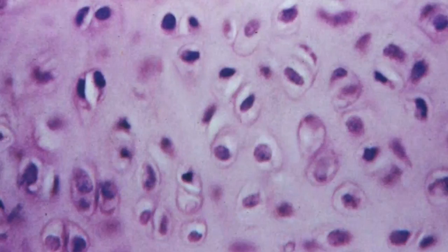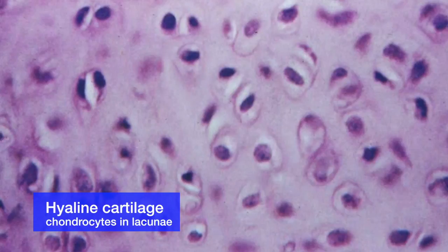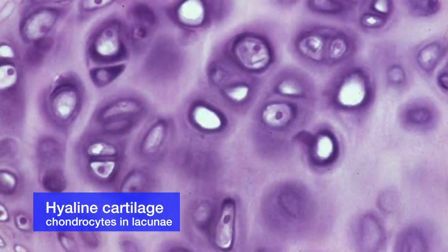The first type of cartilage is hyaline cartilage. Hyaline cartilage takes its name from a Greek word, hyalos, or glass. The name is appropriate because the low amount of collagen in the matrix gives hyaline cartilage a shiny and translucent appearance.